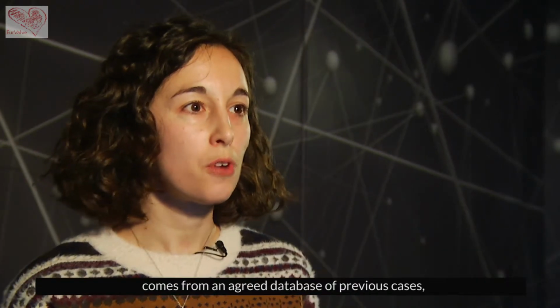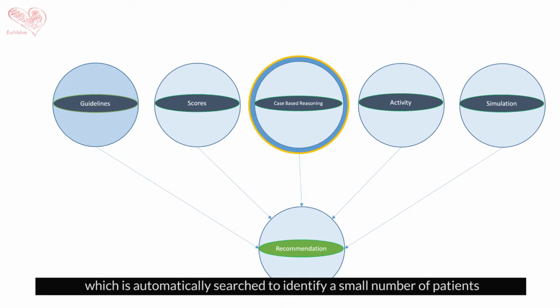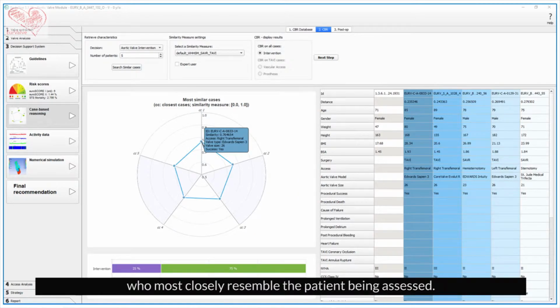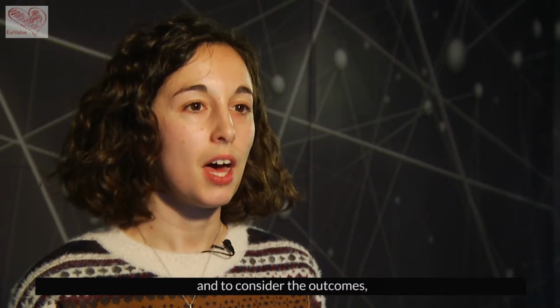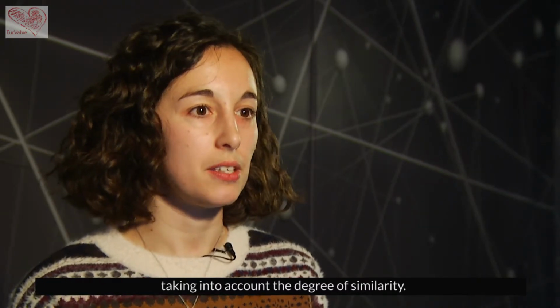The third contribution of information of potential benefit to the clinician comes from an agreed database of previous cases, which is automatically searched to identify a small number of patients who most closely resemble the patient being assessed. This enables the clinician to explore the decisions made in these previous cases and to consider the outcomes, taking into account the degree of similarity.